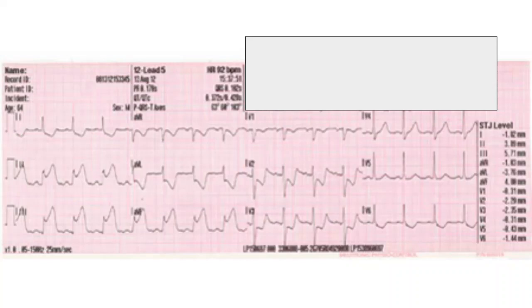Let's go into the first one. I know this is a little blurry, but in the real world not all EKGs look like you would like them to look. Take a second, pause the video if you need to, and then come up with your interpretation.